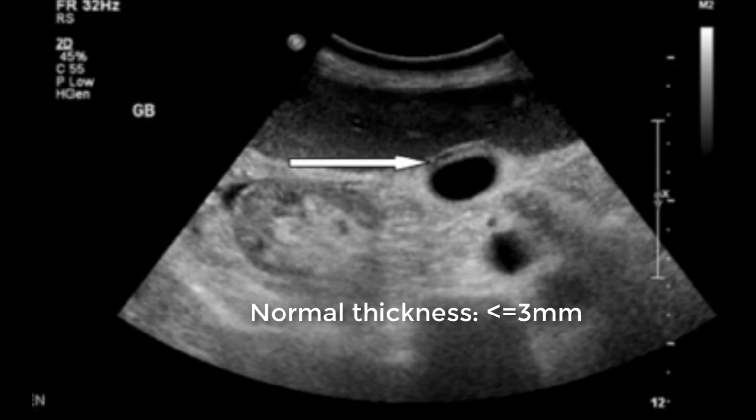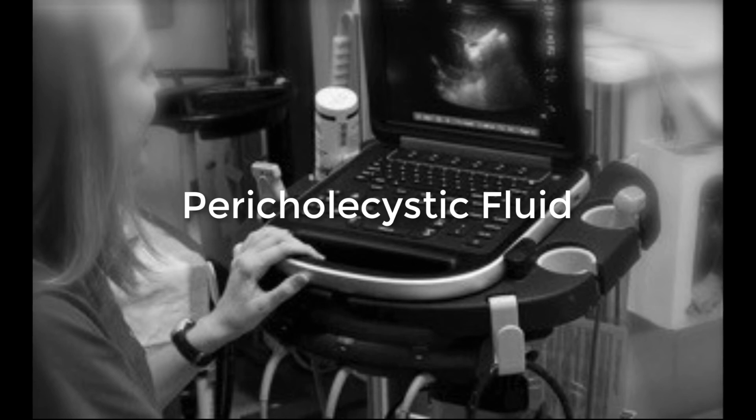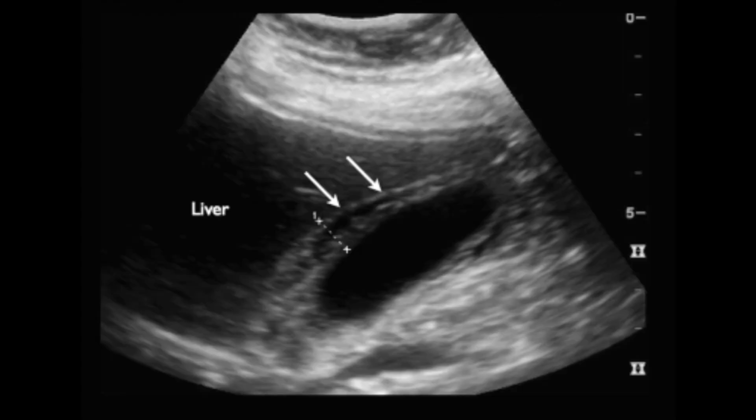Gallbladder wall thickening is measured at the narrowest point of the anterior gallbladder wall in short axis. Normal wall thickness is accepted to be 3 millimeters or less. Note that gallbladder wall thickening is more sensitive than specific, as there are many pathologies that can lead to wall thickening. Pericholecystic fluid is a more specific finding for acute cholecystitis when it is present in the setting of a patient with a high clinical suspicion.